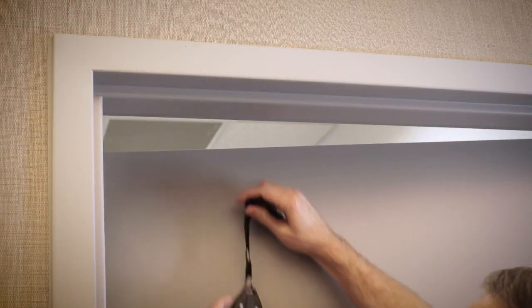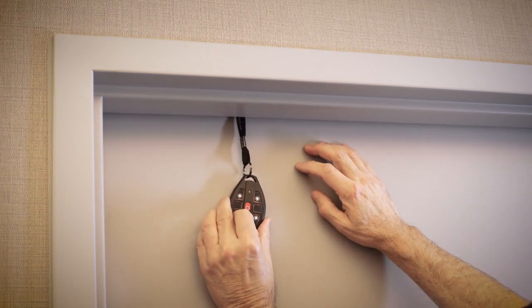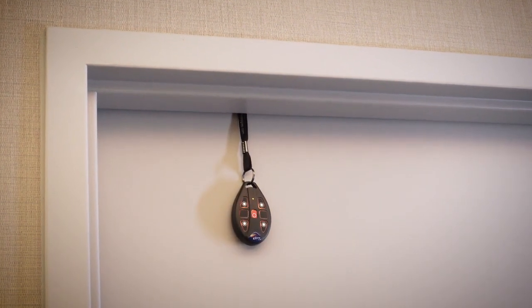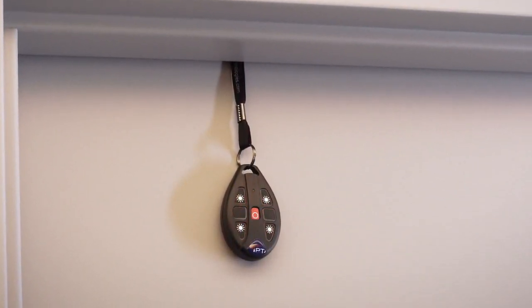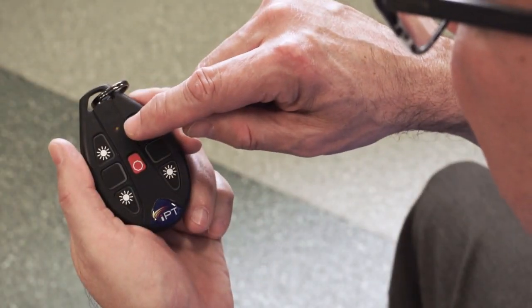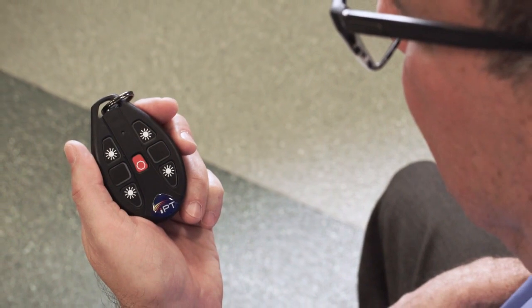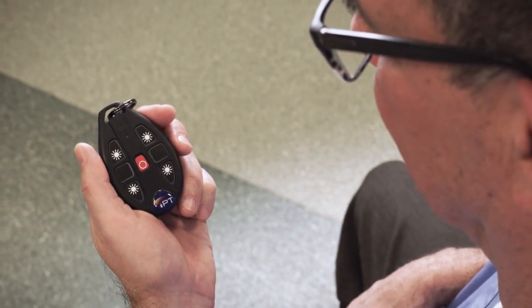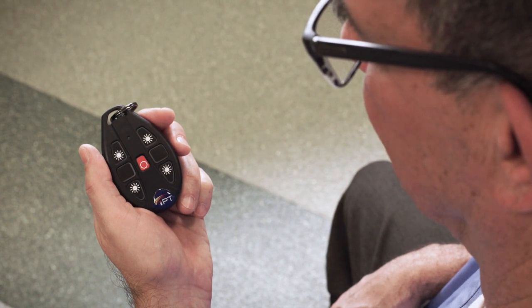To prevent unintended UV exposure, hang a door sensor on every entrance to the room being treated. The door motion module is powered by a 3-volt CR2032 button battery and will need to be replaced periodically. When it's time to replace the battery, the LED will blink rapidly when arming the sensor. After the five-second blinking period, the DMM will operate normally. Refer to the user manual for instructions on replacing the battery.